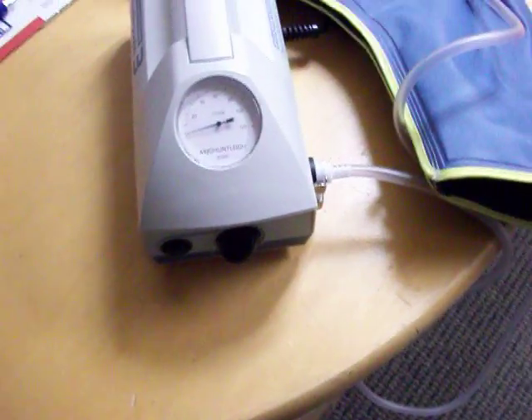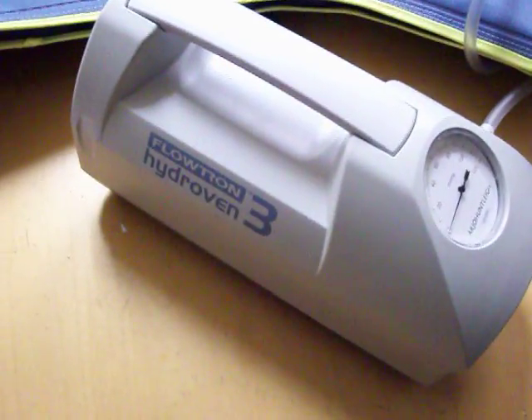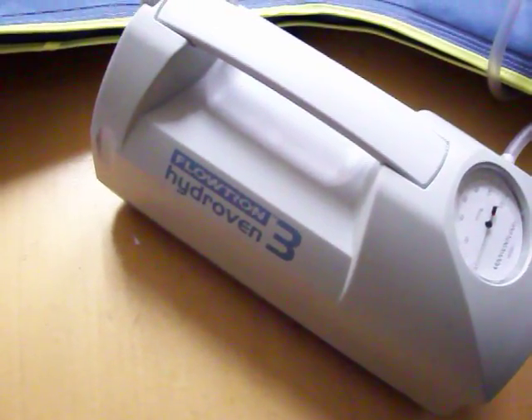This is GoSouthernMD.com's lymphedema pump, made by a company called Arjo Huntleigh. This is the Flowtron Hydroven 3. You can see the compression gauge, and these are the different knobs that I'm going to show you — you turn them up and down to adjust the compression.